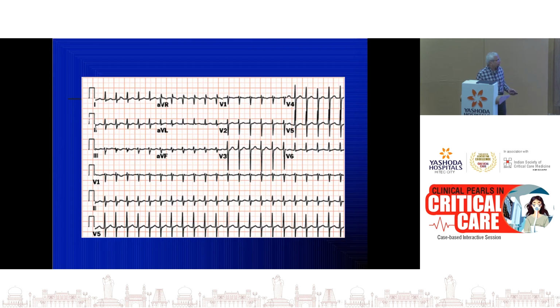This is another example of a supraventricular tachycardia. It is enough for us as an ICU physician or a critical care physician to identify this as a supraventricular tachycardia or a ventricular tachycardia.